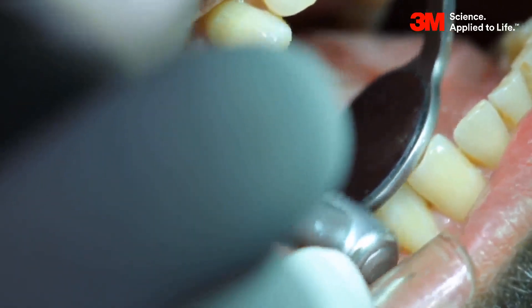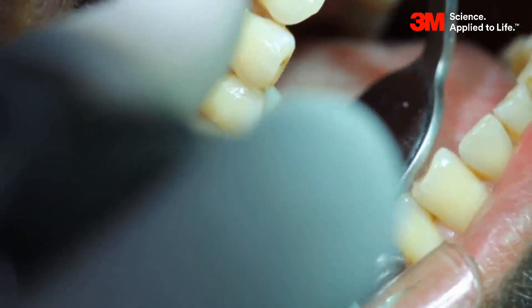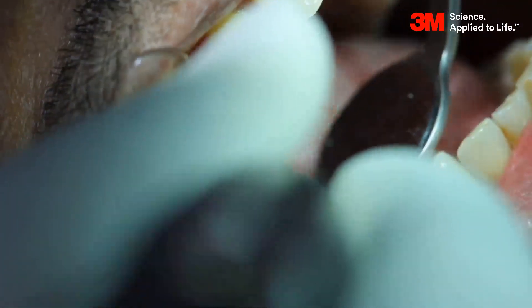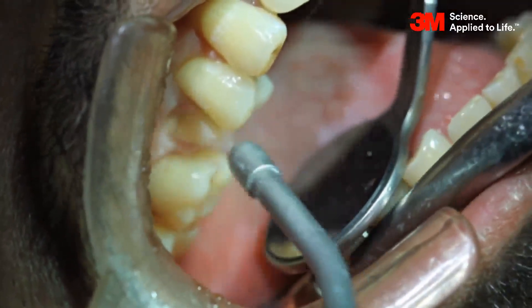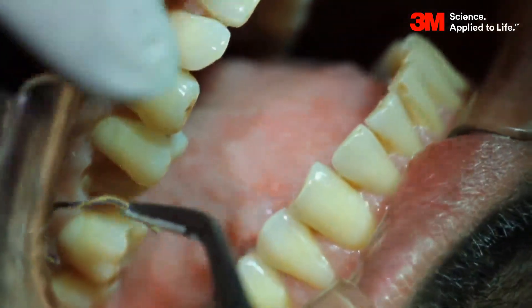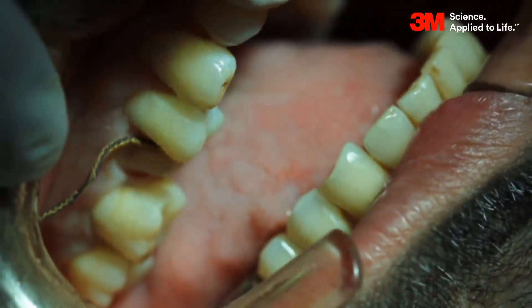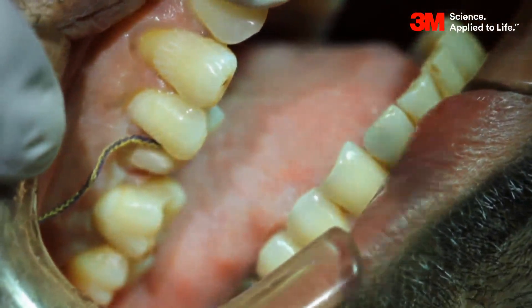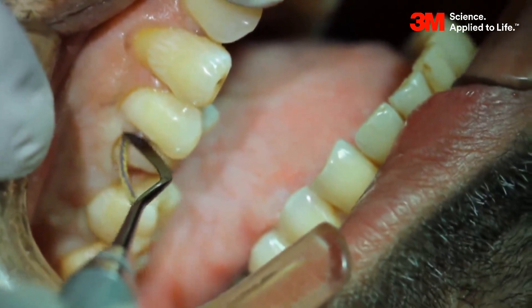Use a three-way syringe to isolate the area. Remove the roughened margin using a rubber cup. Isolate the area before you do the gingival retraction. Using the cord packer, retract the gingiva towards all surfaces of the tooth.